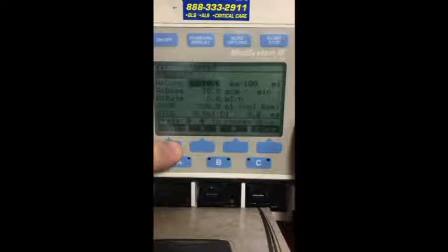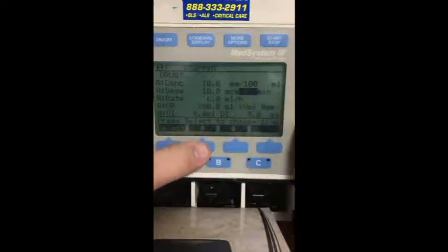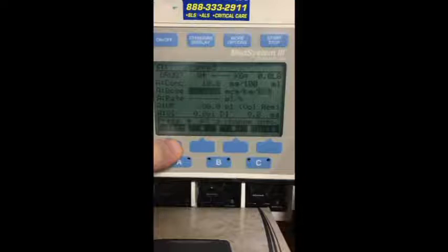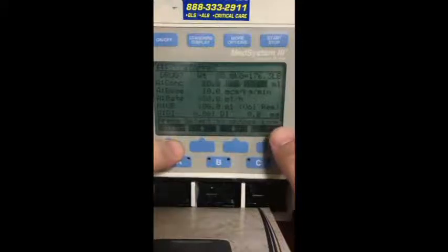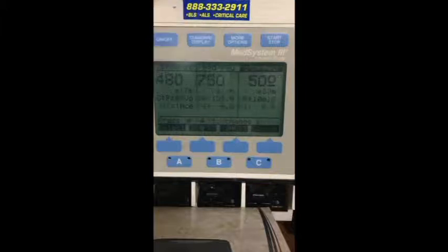If it was a weight-based, you'd go to the dash, and then you can get it back. So here we have 10 milligrams and 100 mLs, and now we chose weight-based, and so obviously we have to put in a weight. When you put in the weight and the rest of it, it automatically calculates your rate, just like it did for the other ones.